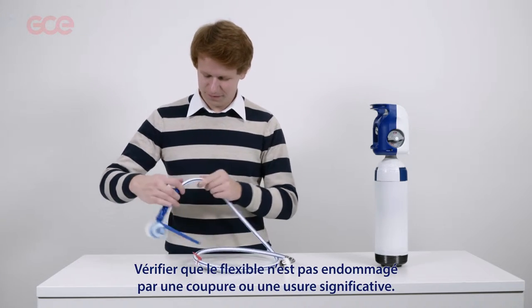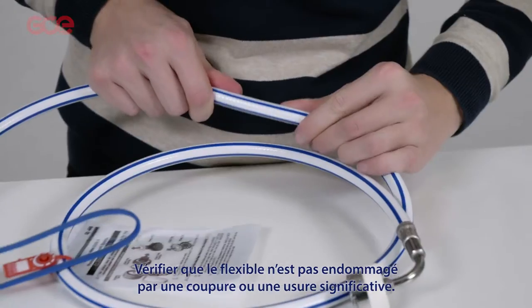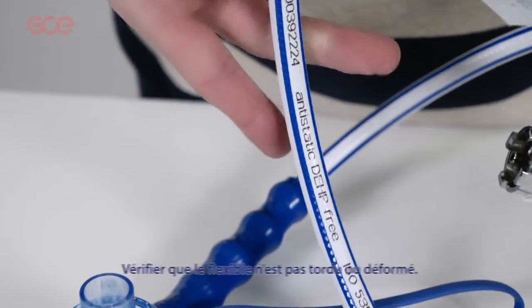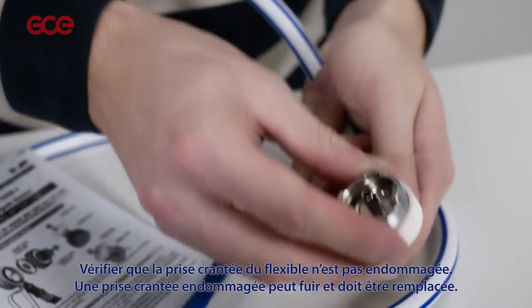Check the hose has no damage to its outer cover, such as cuts or significant abrasions. Check the hose is not kinked or misshapen. Check the metal probe connector of the hose is not damaged or worn.